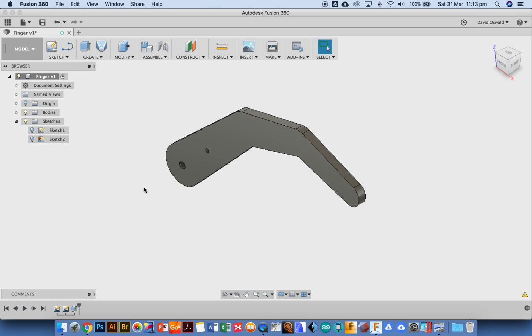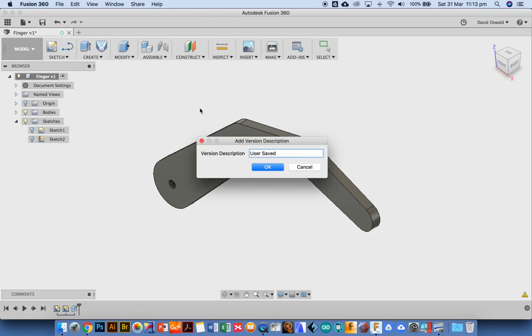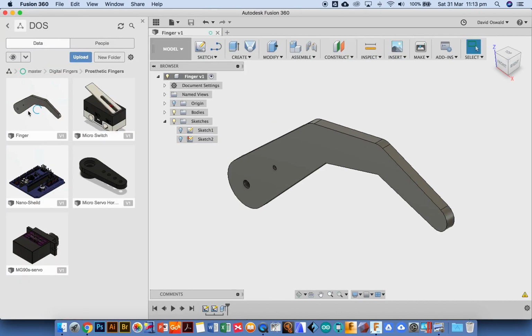So let's just turn that off now. Very importantly, we need to save it. And we're done for that stage. You should see, if you open up the folder, you should see it saving here, and the first part of your robotic hand or your prosthetic finger is actually started to be created.